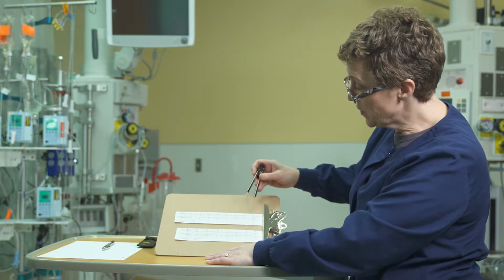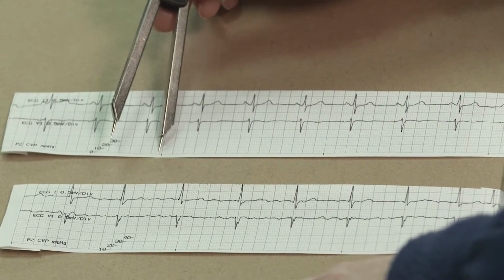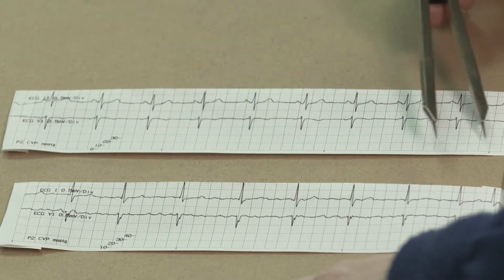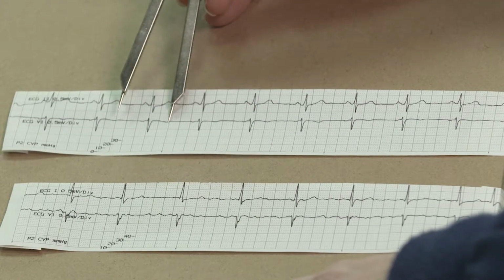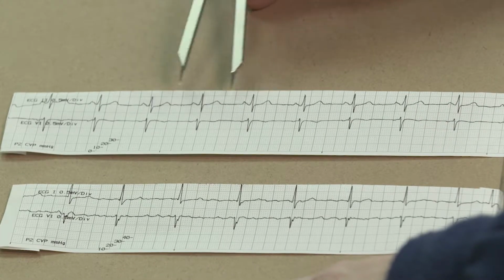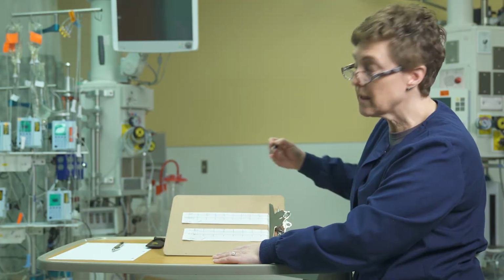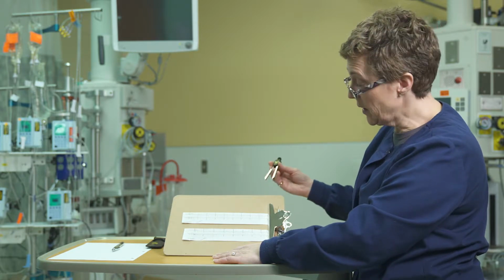One of the things to notice on any tracing is these are 3 seconds apiece. So there's 3 seconds, there's 3 seconds. That is a 6-second strip. So if I take my rate, beginning at this line, ending at this line, I can get a ballpark rate, 1, 2, 3, 4, 5, 6, about 60 to 65. So that makes me happy that I can continue on.